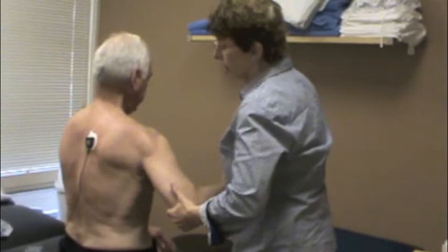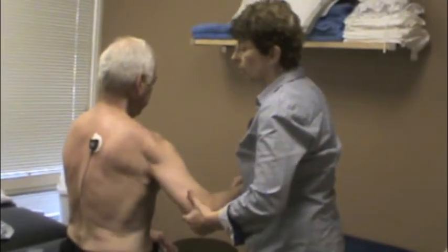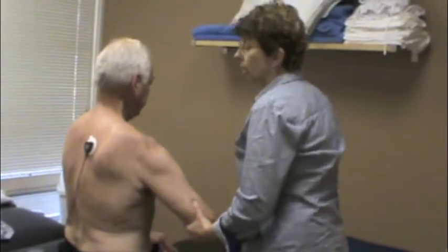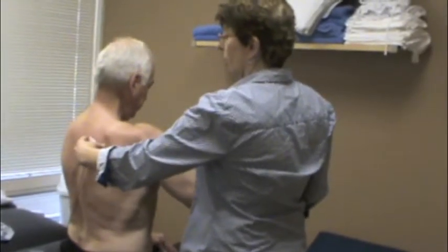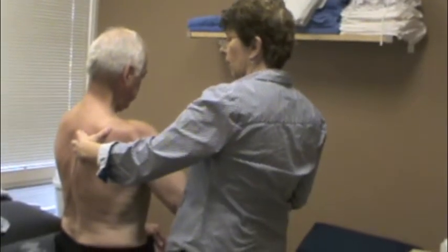And again. Good, and one more. Good. Now pull that in — pull — there you go, good. Now let the arm bend.